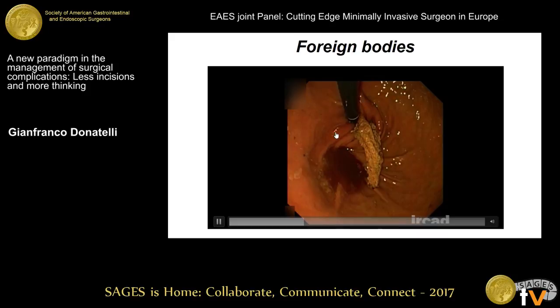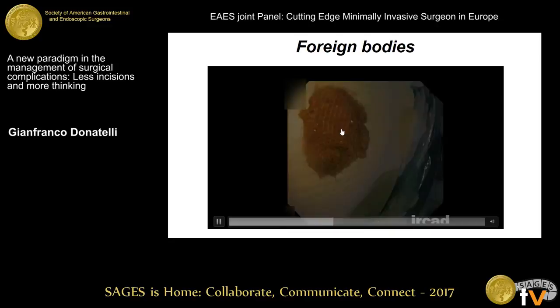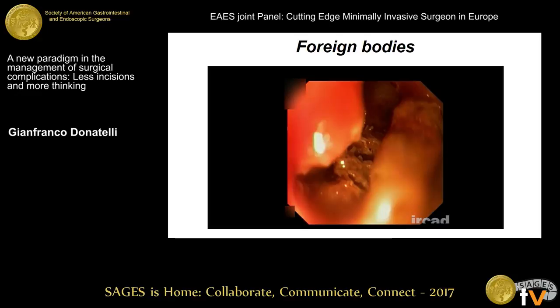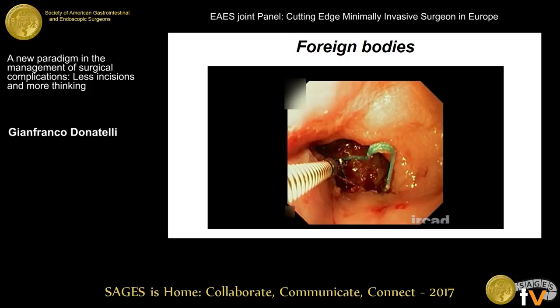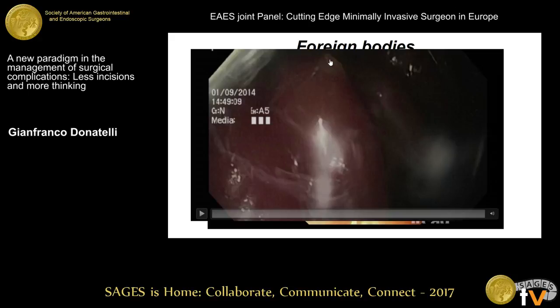So you have to think of all the tools that you can utilize to remove it. This is the first part of the mesh. Again, with the foreign body forceps, I pulled it without too much force, but anyway, there was a big surgeon with me, so I said, whatever happens, I cover it. Still there was a stitch and they cut the stitch. So did you see, we can remove foreign bodies implanted by surgery, by endoscopy.